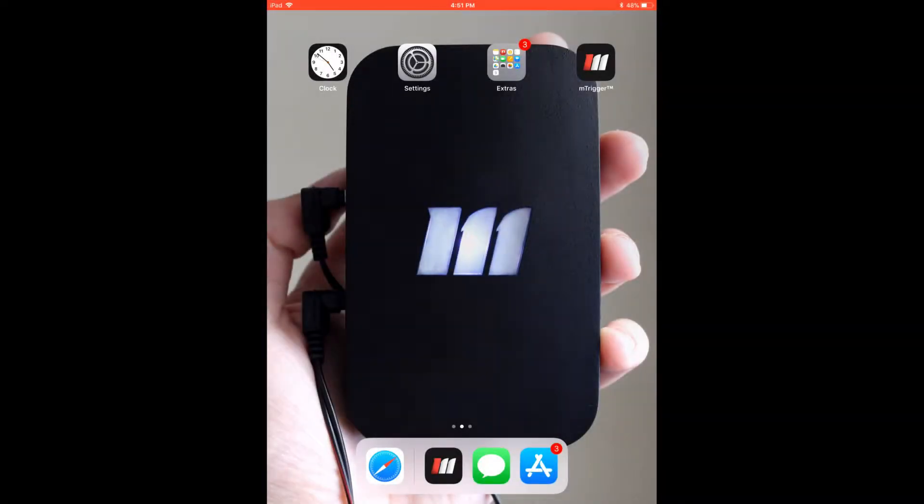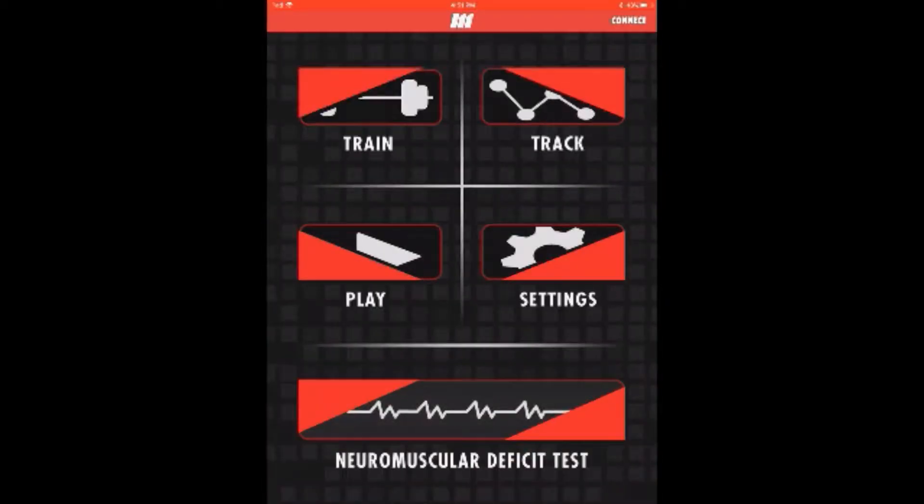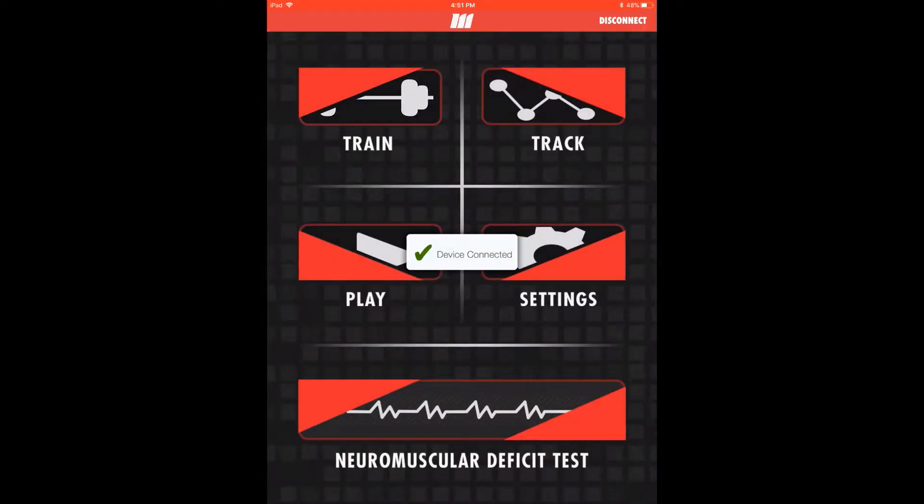Welcome to the walkthrough of the mTrigger biofeedback system application. We're glad you're here. To begin, download and open the mTrigger app on your mobile device. Tap connect to pair your device over Bluetooth, and now we're ready for settings.